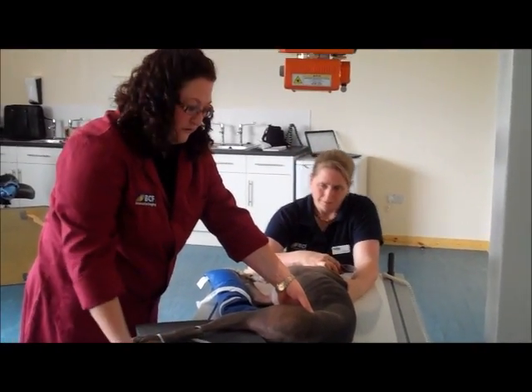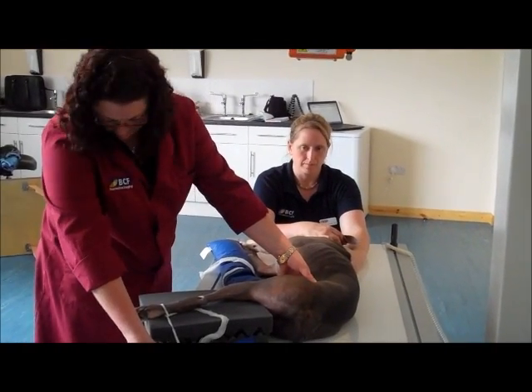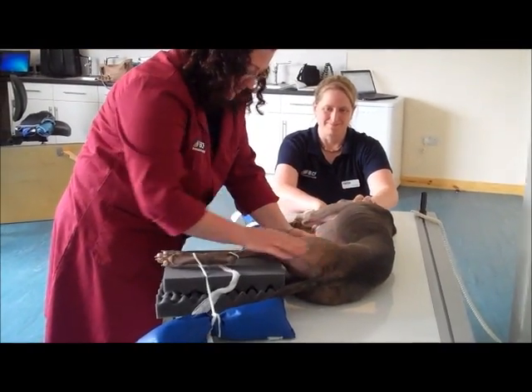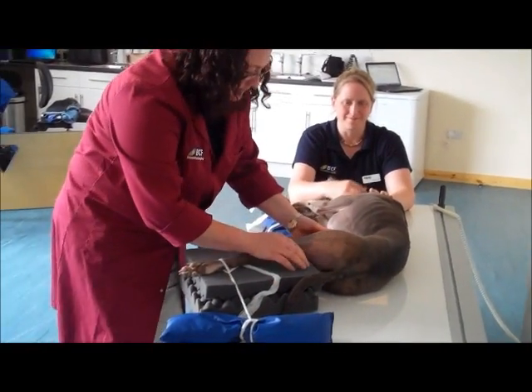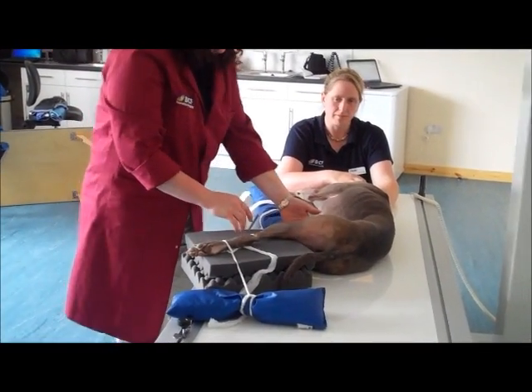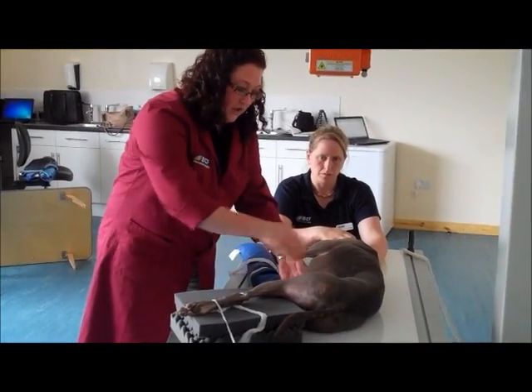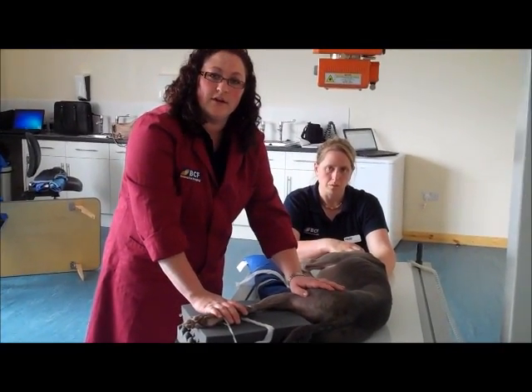With a floating top table such as this, it's quite easy to manoeuvre. We'll just reposition, double check — that looks good — and we're nicely collimated. Sometimes you can include the stifles if you're wanting to evaluate that as well, just bear in mind that the focus is going to be up near the pelvis. So now we're ready to take our radiograph.